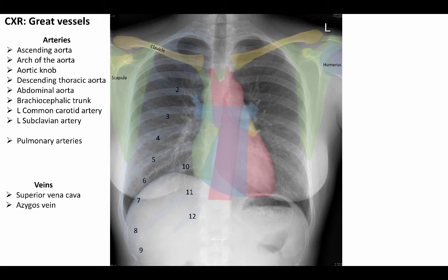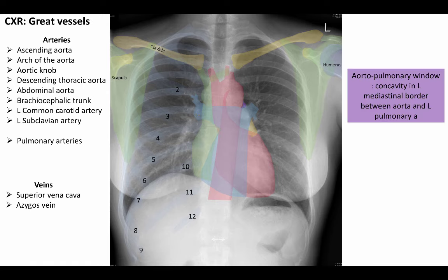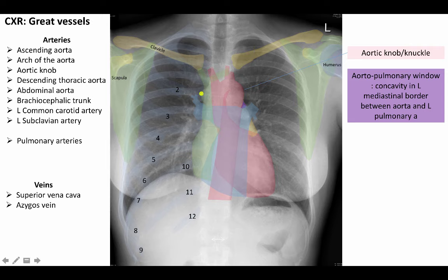The great vessels can be seen emanating from the heart. Here we see the brachiocephalic trunk, and here the left subclavian artery. Here again we see our ascending aorta, arch of the aorta, and descending thoracic aorta. Here we can see the left and right pulmonary arteries. A useful way to identify these is to find the aortopulmonary window — a concavity in the left mediastinal border between the aorta and left pulmonary artery. The aortic knob or knuckle is the left lateral border of the aorta as it arches posteriorly and inferiorly. Here is our superior vena cava, and the projection on its lateral wall is the point at which the azygous vein joins this vessel.